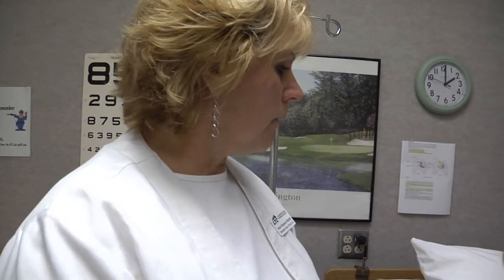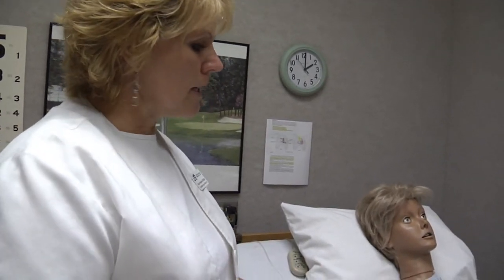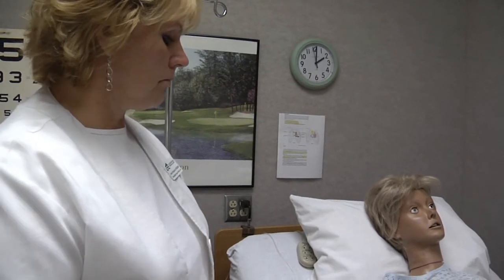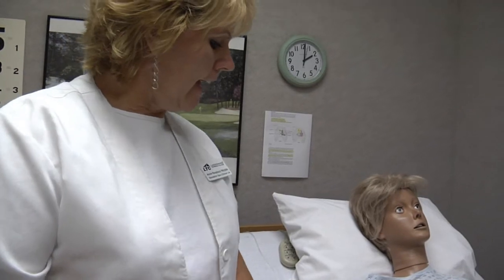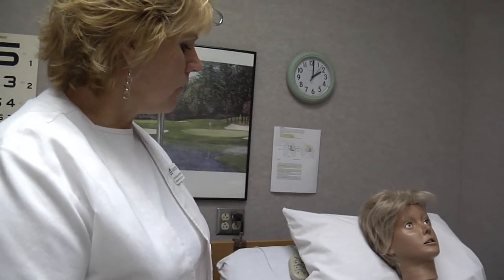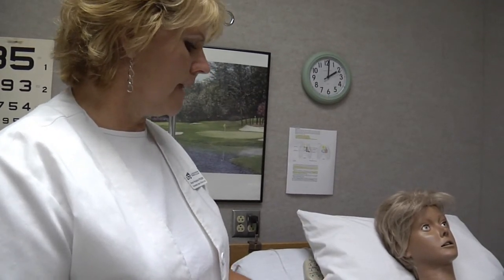So after we've done all of our monitoring of it, we would talk to the patient and make sure she understands the things that she needs to do. So Mrs. Snow, I want to make sure that you understand if you get up and need to use the restroom or go for a walk, you need to bring the IV with you or call for help, and we will help you do that. Try not to lay on the tubing or get it coiled at all underneath you. That can cause some difficulty with the IV itself.